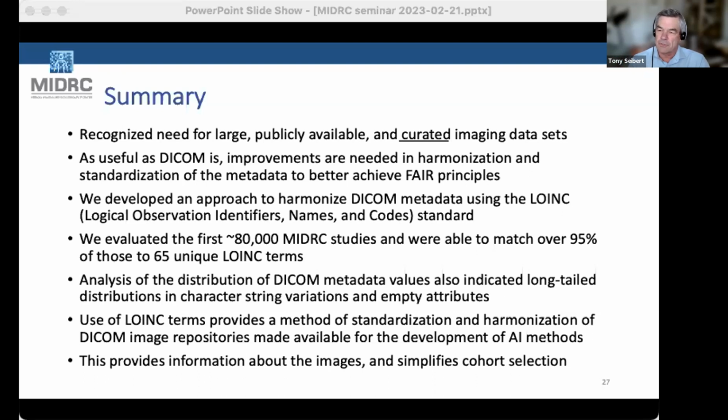Well, before I get to the other questions, I have one more question with respect to the DQH group. Do you have experts on the group that help assign these codes to these images? Because sometimes the study descriptions are a little less obvious. Right. Thanks. Well, we have this one famous expert, Tony Seibert, the RSNA gold medal winner. But no, we have radiologists and very experienced people working with protocols. And then if there's a question, we can go and spot check images.